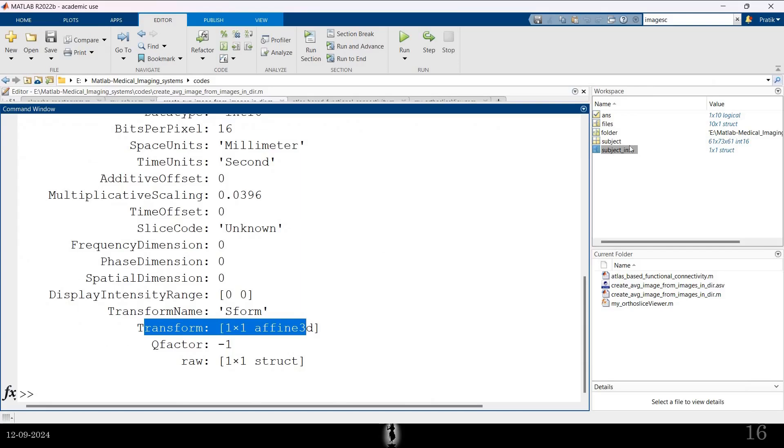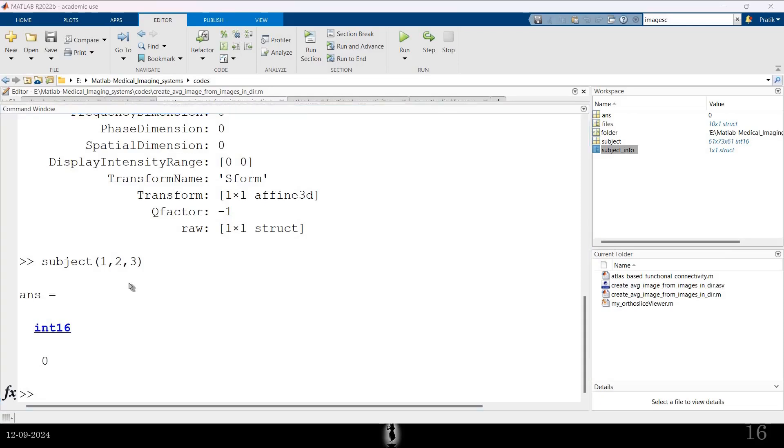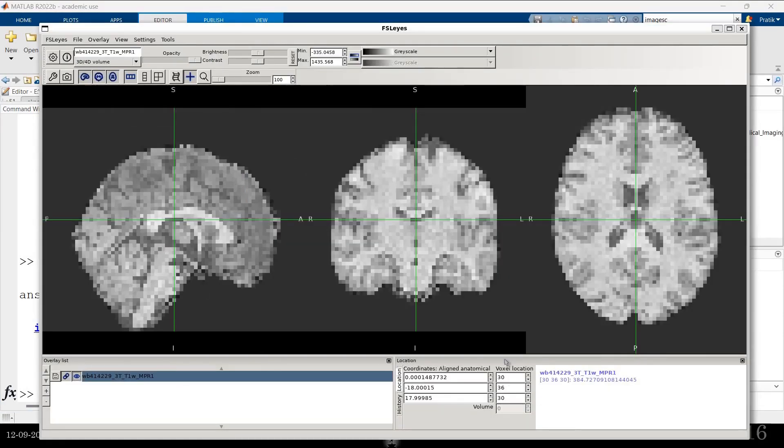I have that image in subject. And if I type subject 1, 2, 3 something like that. The location, this is the voxel location that I'm typing. And the output that I get is the pixel or the voxel intensity at that particular location. So this is what is the voxel coordinates. And those are here. The voxel location or the voxel coordinates.